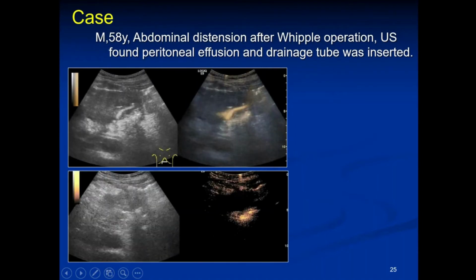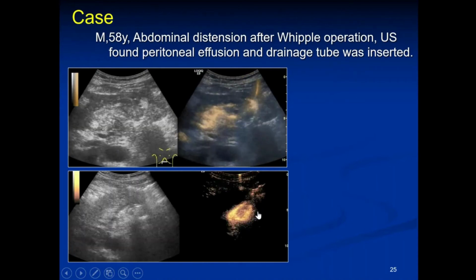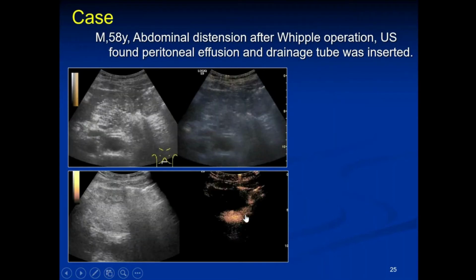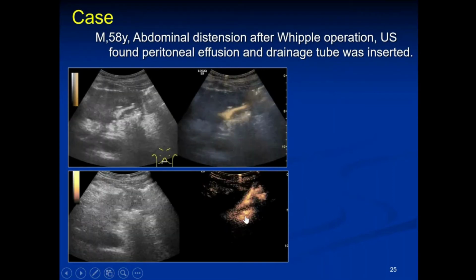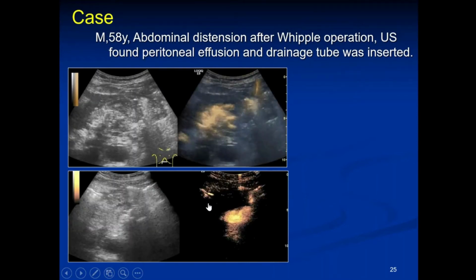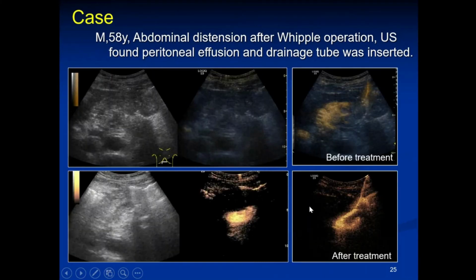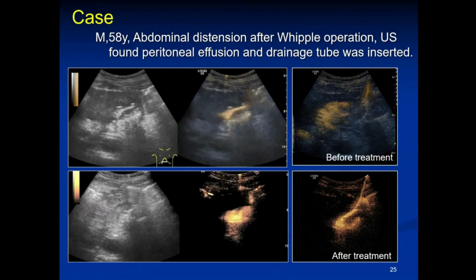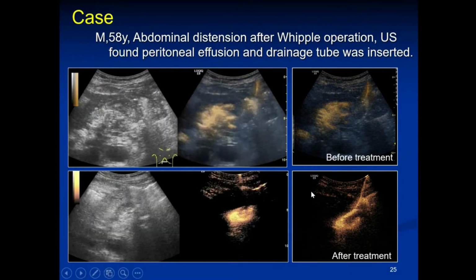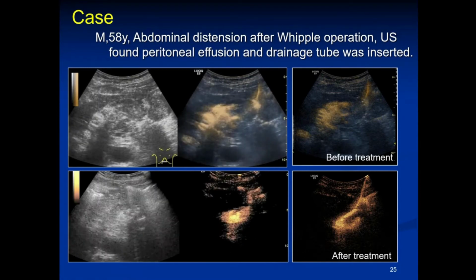After conservative treatment, the fistula was healed, because when we injected diluted Sonovue, we could not see Sonovue in the jejunum. So ICCEUS can help us not only to diagnose, but also to evaluate the treatment effect of fistulas.